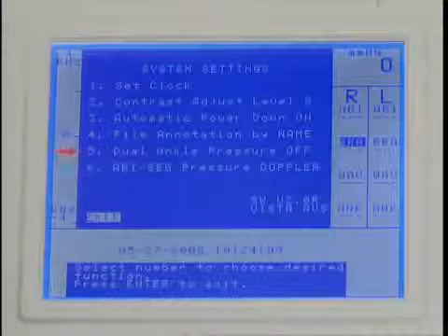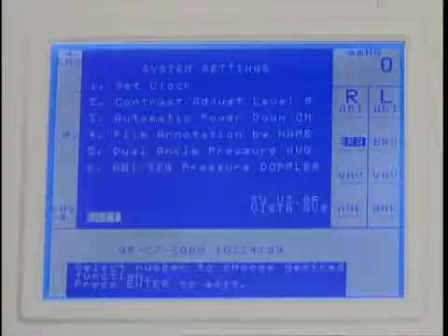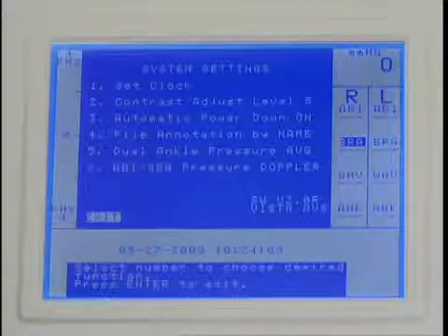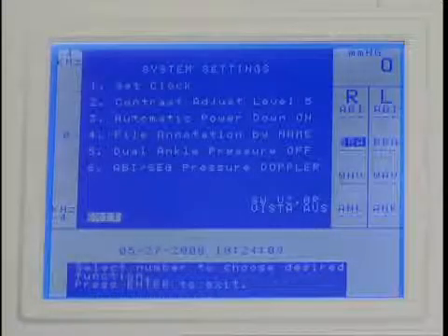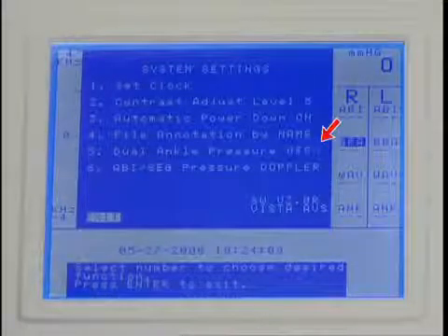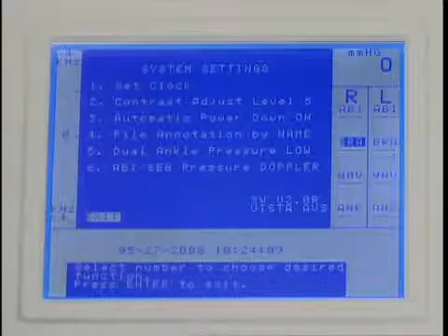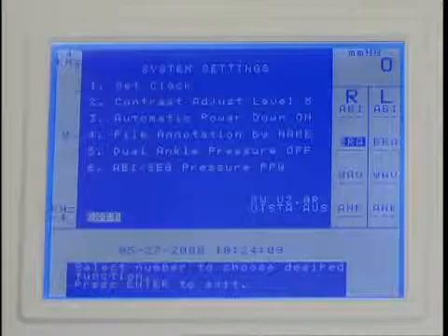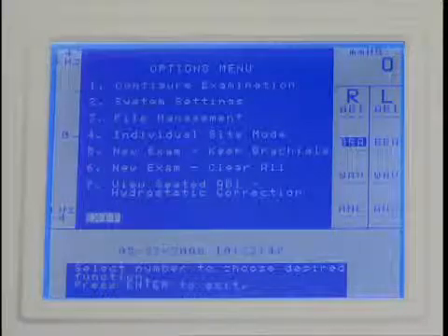The fifth setting is dual ankle pressure, which determines how the ankle pressures are calculated. The Vista AVS can accommodate protocols using either one or two pressure measurements per ankle. There are four options for the dual ankle pressure setting. If you need one pressure from each ankle, set this parameter to off. If your protocol requires pressures from both the posterior tibia and the dorsalis pedis, set it to high, average, or low, depending on which you will use for the ABI calculations. The sixth setting is for selecting either Doppler or PPG for obtaining pressures while performing an exam. The remaining topics in the options menu are discussed in detail in specific sections of this video.